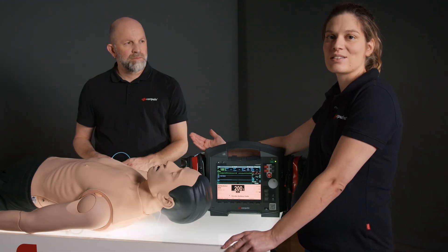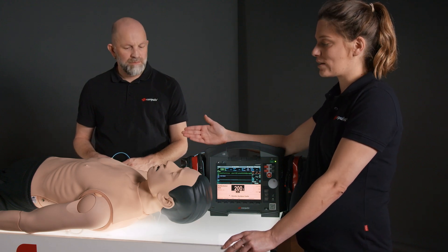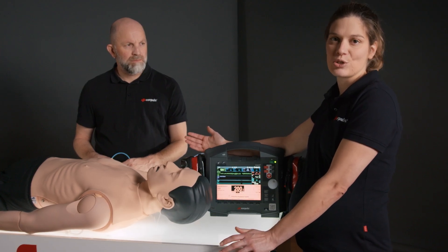To apply the therapy electrodes it is necessary to prepare the patient completely. This means the upper body must be unclothed, hair-free, and dry. Jewelry positioned between the electrodes should be removed beforehand.